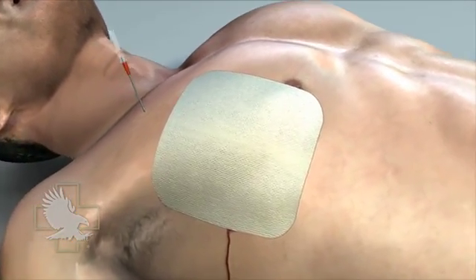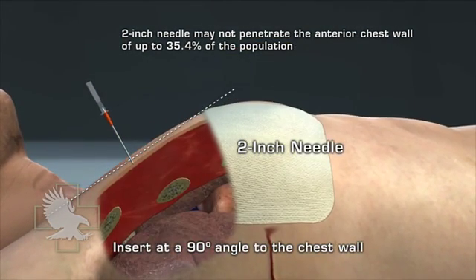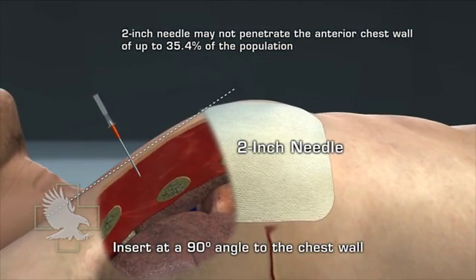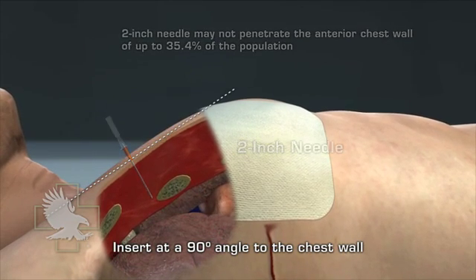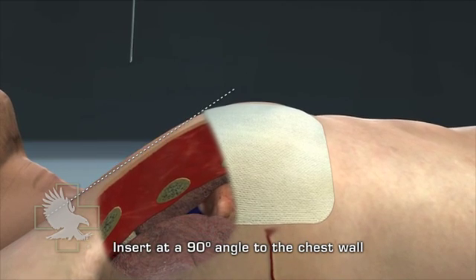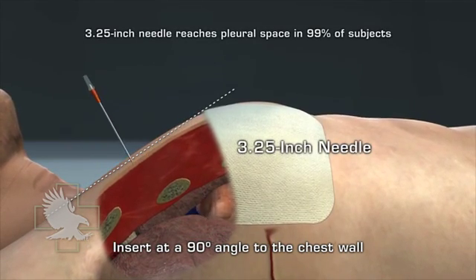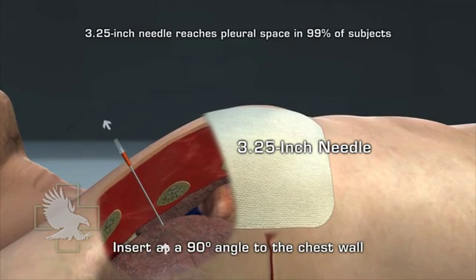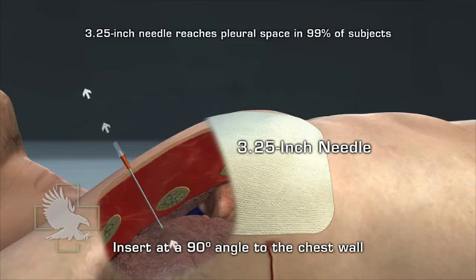In a study published in the Journal of Trauma, it was found that a two-inch needle may not penetrate the anterior chest wall of up to 35.4% of the population depending on age and gender. A study in Military Medicine recommended that needle thoracentesis to relieve tension pneumothorax should be performed with a needle of sufficient length, and that a 3¼-inch needle would have reached the pleural space in 99% of the subjects studied.